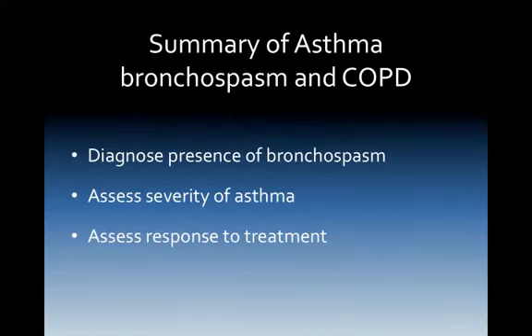Summary of asthma and bronchospasm and COPD. Diagnose the presence of bronchospasm. It helps with that. It gives us a nice shark fin appearance instead of a nice flat, elevated plateau. It assesses the severity of the asthma and assesses the response to treatment.